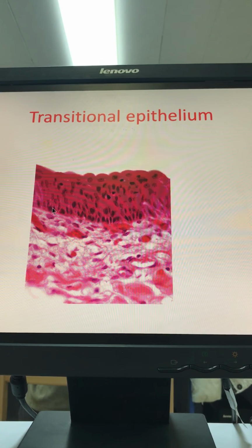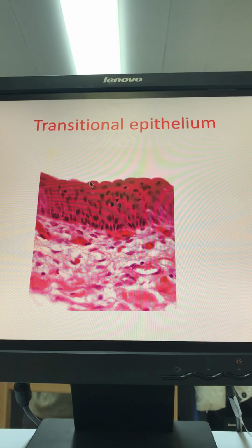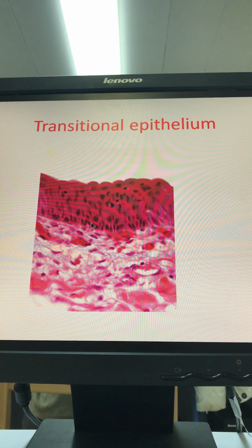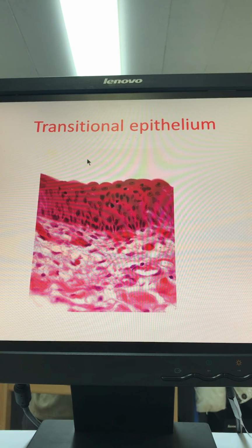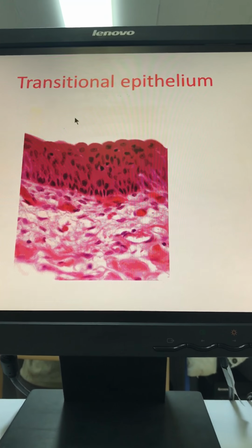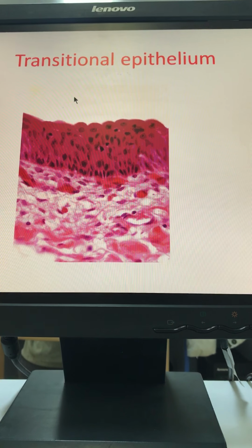Now, طلعوا لي هون. I have here the space. I mean, this is the apical part of the cells or tissue. Here, the basal part. This is my epithelium. يعني على طول بس نشوف إنه gland أو facing a space بحكي هذا epithelium. أي tissue facing a space نحكي عنه epithelium. Epithelium is always a lining or a covering tissue أو بيعمل لي glands. Okay. إذا glands covering lining tissue على طول epithelium.